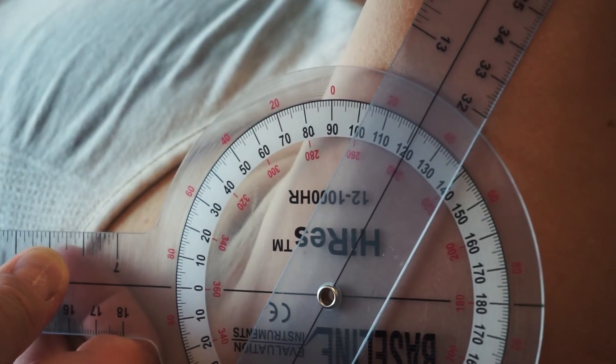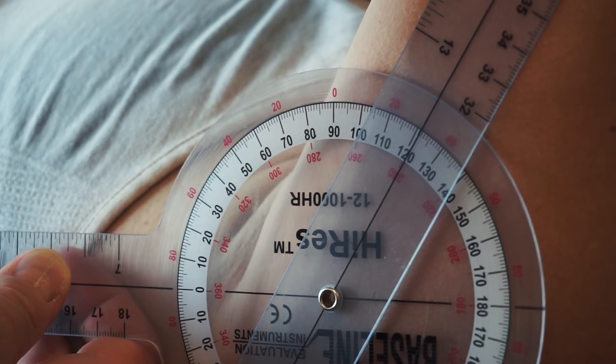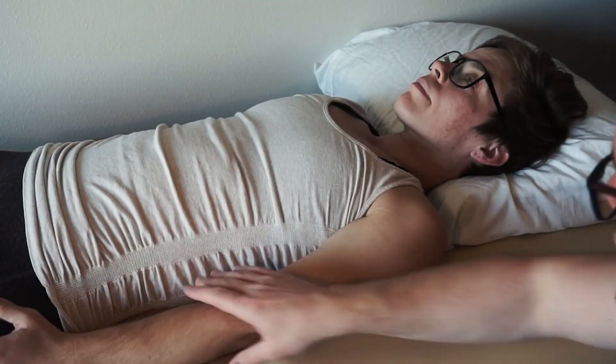I'm going to apply some pressure and find that end-feel. Feel that firm end-feel right there. 122 degrees — that's our shoulder flexion passively.